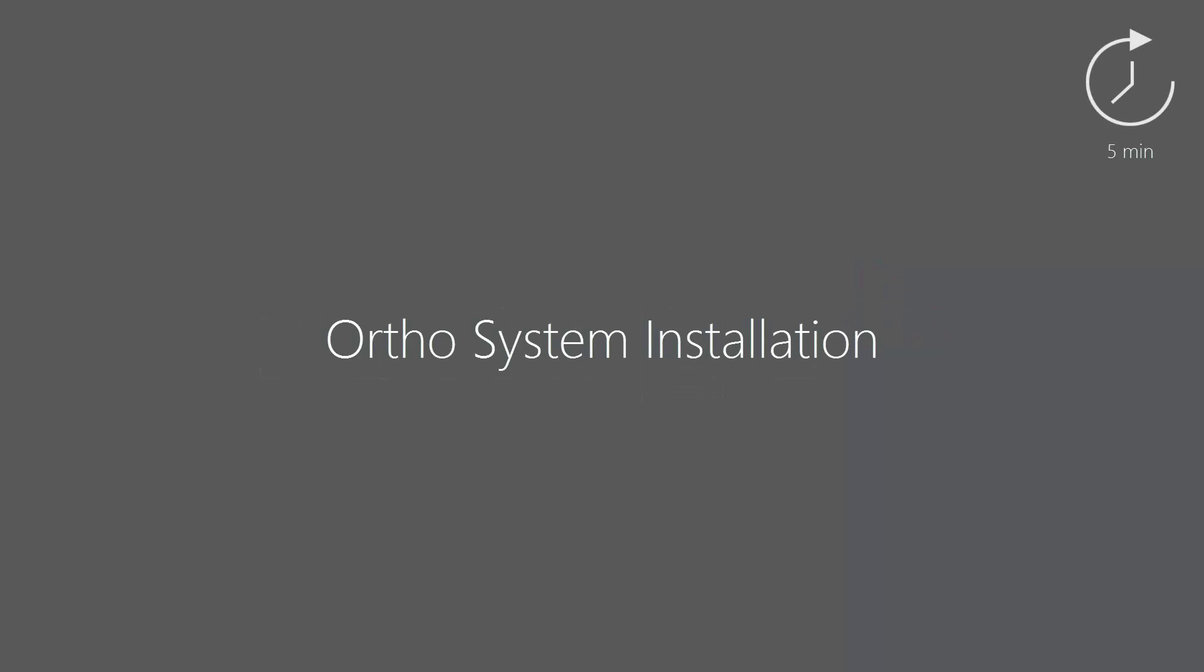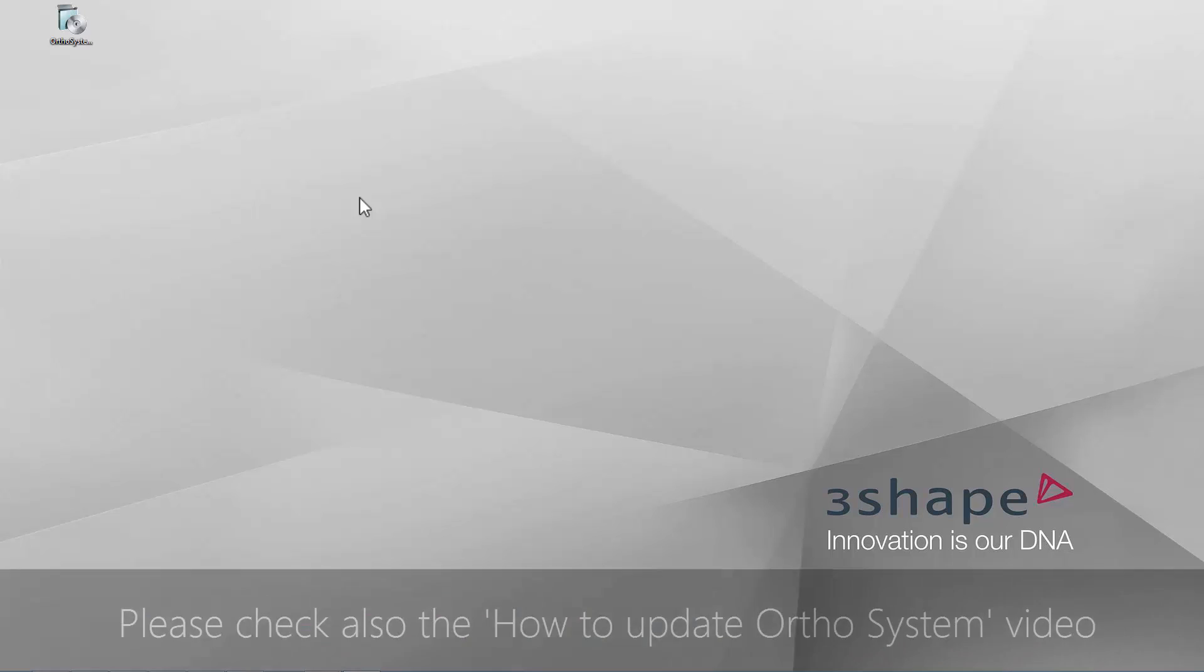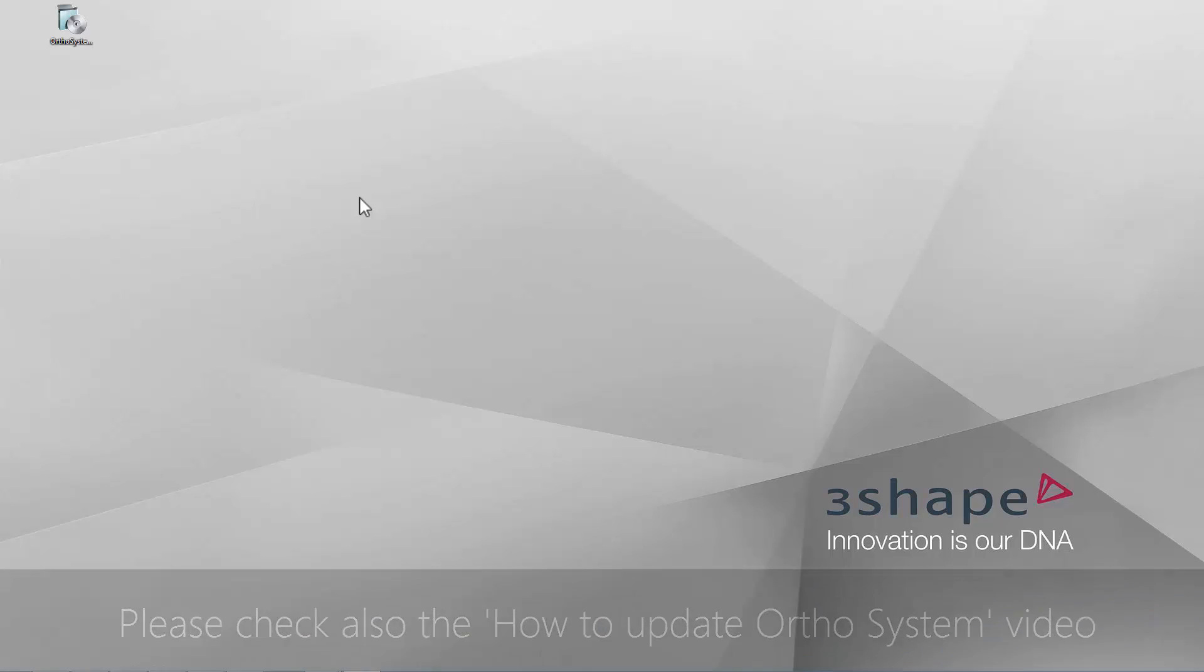In this video you will learn how to install OrthoSystem 2015 on server and client PCs. This video describes the so-called clean installation, which means installing the OrthoSystem on a PC that didn't already have a previous version of 3Shape Ortho software. For more information on updating the Ortho applications, you may also watch our How to Update OrthoSystem video.